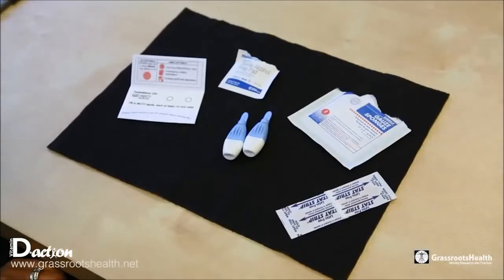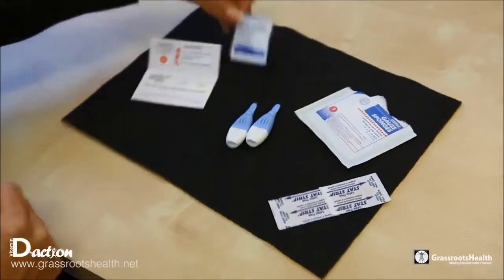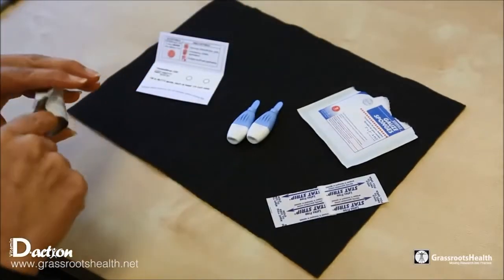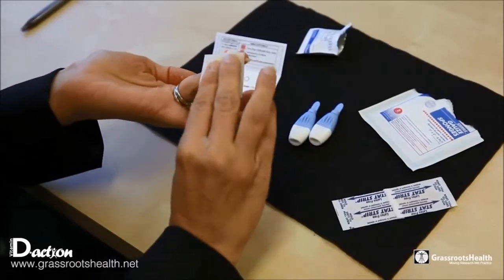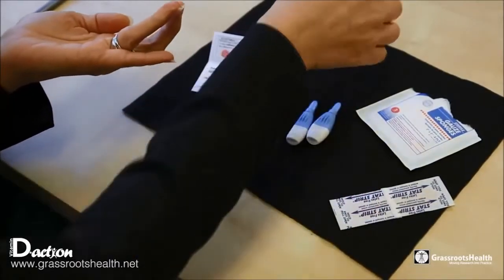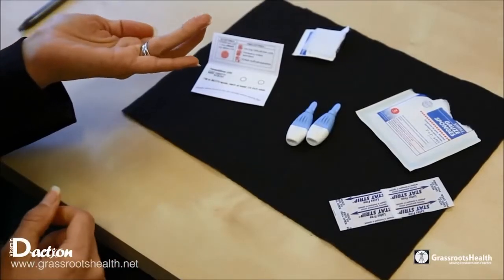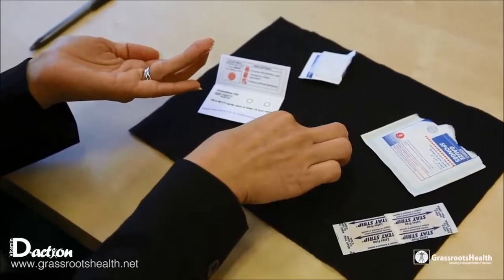Now you will go and wash your hands, and once you have done that, come back and open up the alcohol pad and wipe the finger you are going to use for your blood spot. Choosing a finger on a non-dominant hand is generally a good idea, and you're going to use the lancet into the side of the finger.